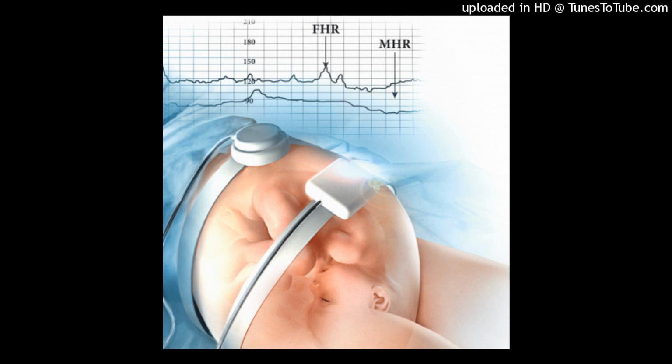Deceleration shape, depth, duration, and timing in relationship to contractions may vary. Variable decelerations are the most frequent type of deceleration during first and second stage labor. Variable decelerations are suggestive of an interruption of oxygenation at the level of the umbilical cord, where cord vessels may be compressed.